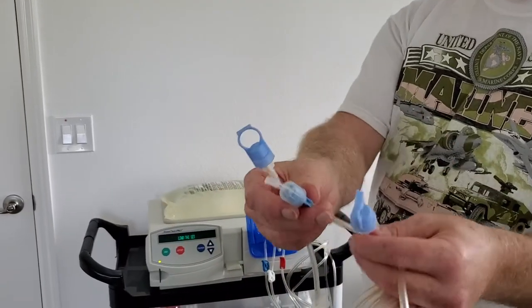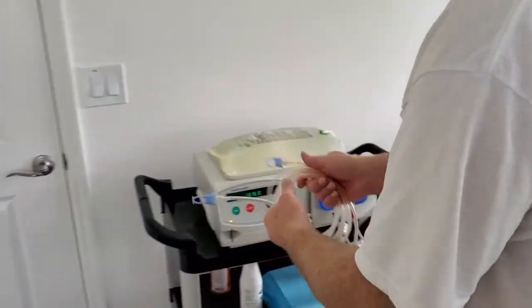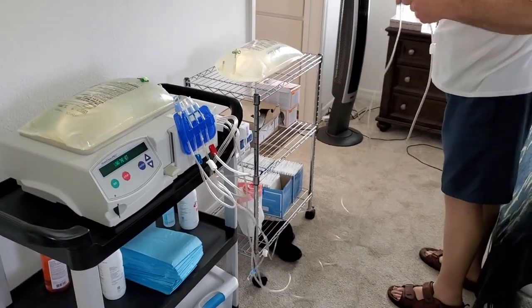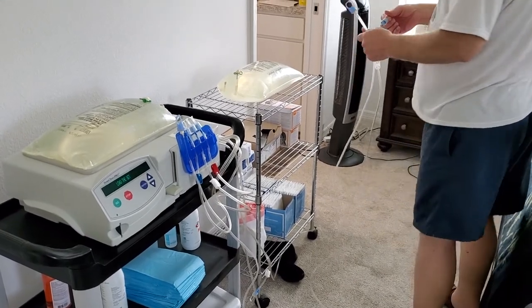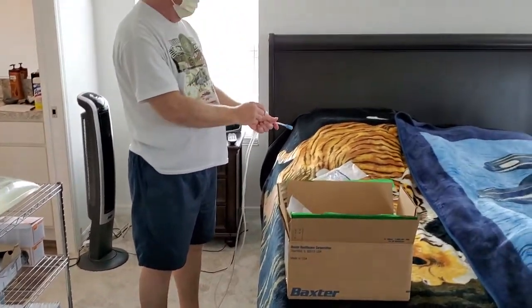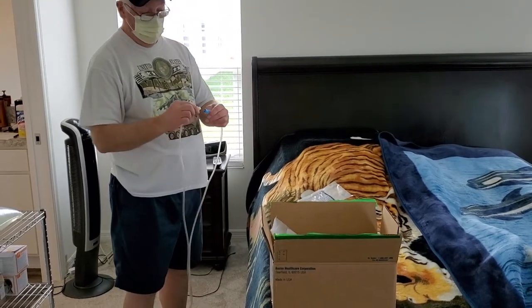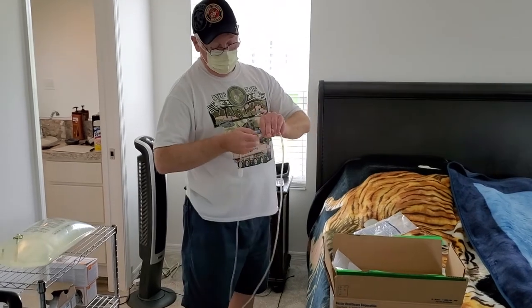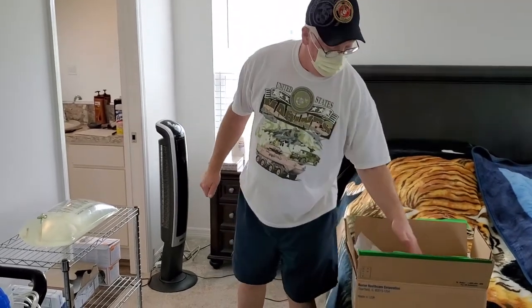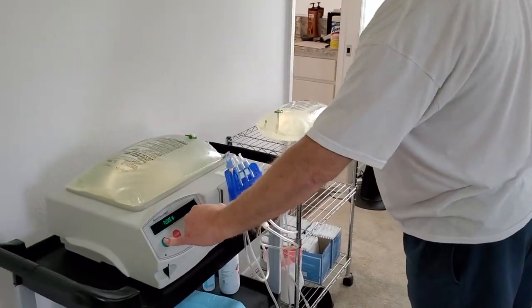I'm going to place the patient extension line in, also making sure it's stretched out with no kinks in it. Pop the tops on them and toss them aside — I keep my eyes strictly on the patient extension line. Twist them in together, then pick up my caps and garbage and hit go.